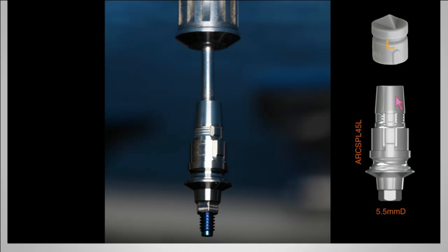Now, I could have also seated the tie base directly in the patient's mouth, but the tie base would have ended up subgingivally, making it very difficult to line up this scan body with this notch. Visible detection is required so that the clinician can properly align this notch of the scan body with the notch of either the tie base or the scan post.